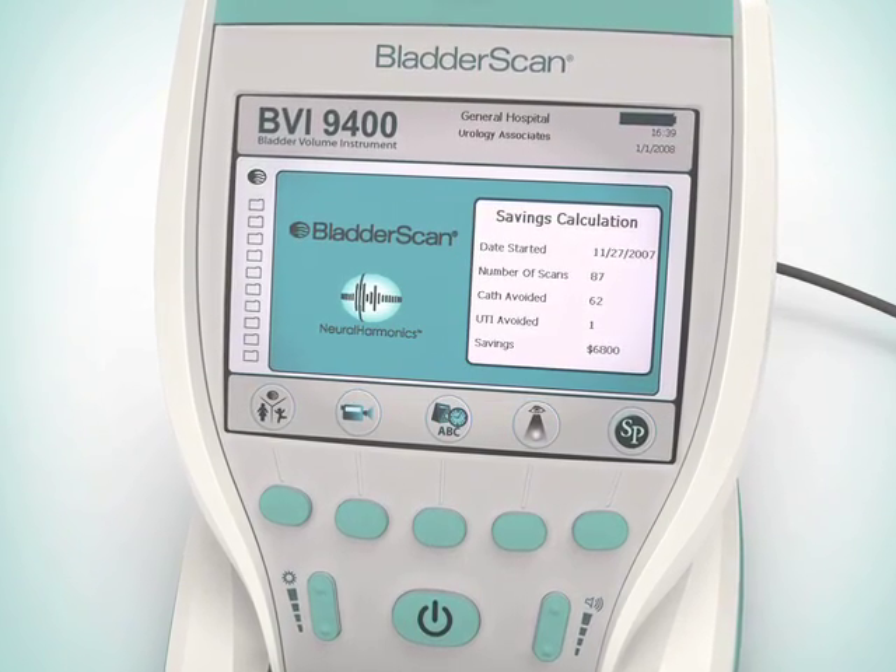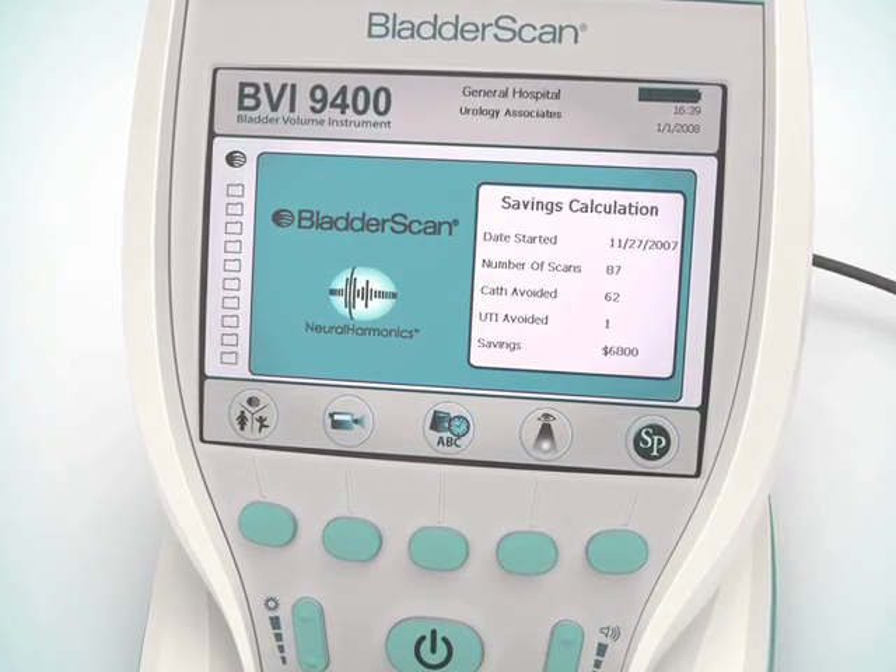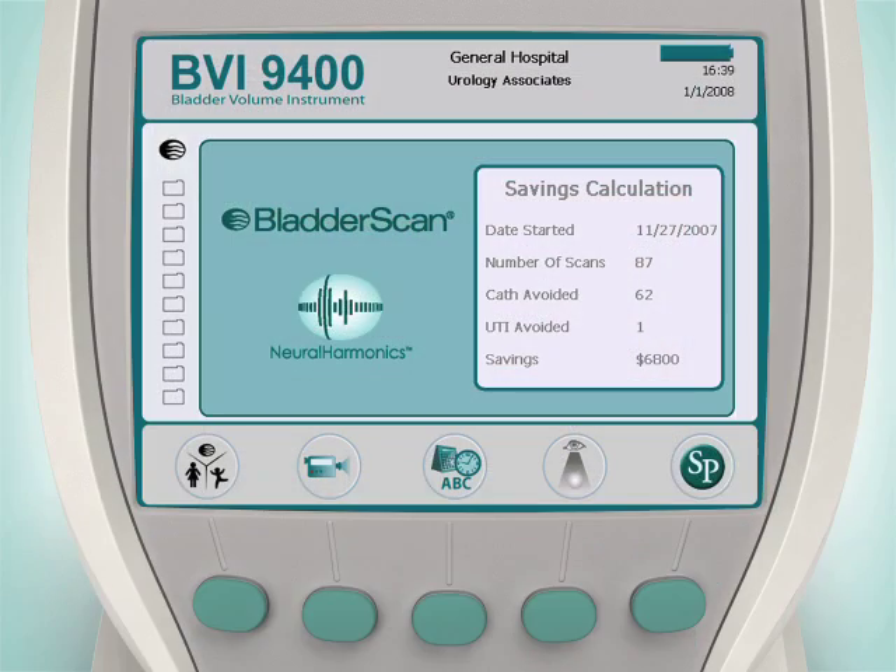The BladderScan BVI9400 is designed to scan in three patient-specific modes. To begin, first select the proper exam mode to ensure the accuracy of your scan. Simply press the Mode button repeatedly until the desired setting appears.